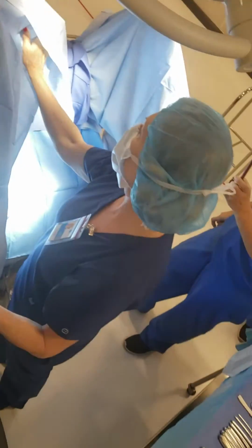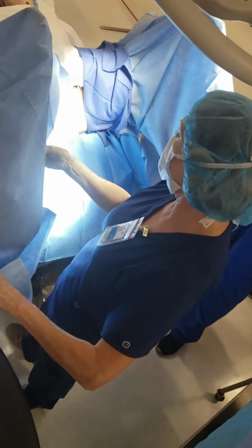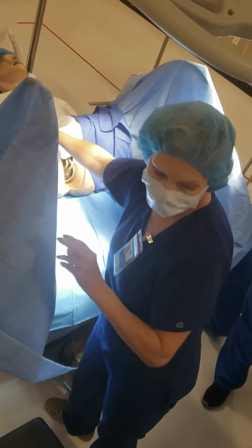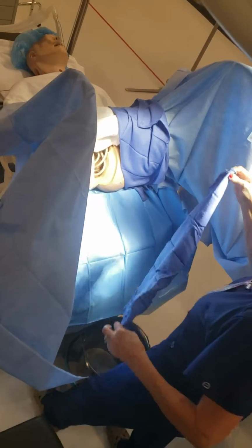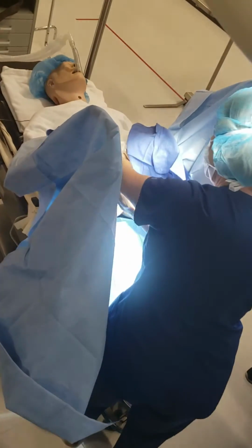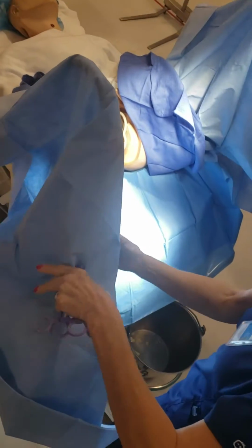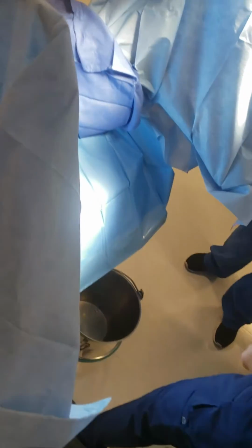So your hands are in here. And this is when you guys are talking about the plastic towel clamps. This is when the doctor usually asks for some plastic clips. They ask for plastic clips, and that's when they put those on here, just to get rid of some of this and clear the way. Those aren't plastic clips? No, they look kind of different than that.